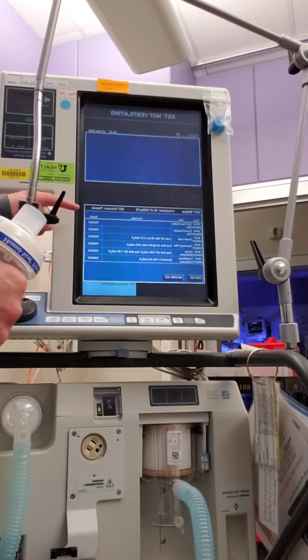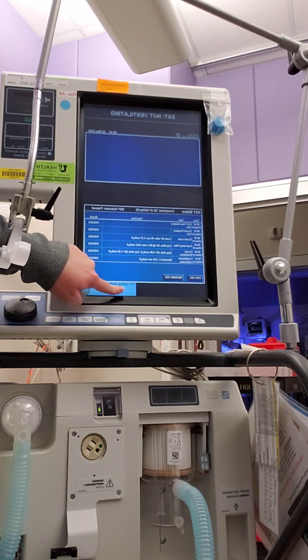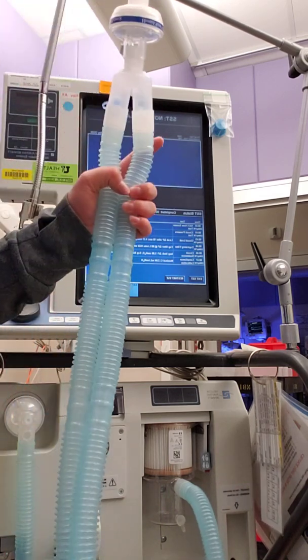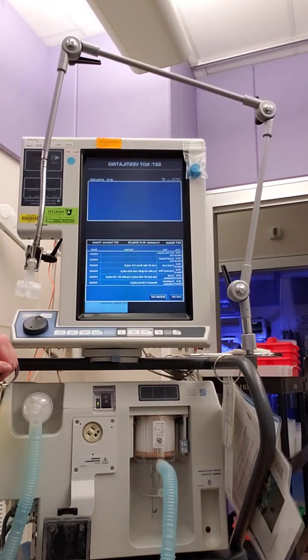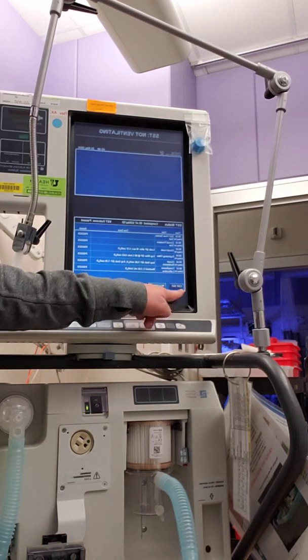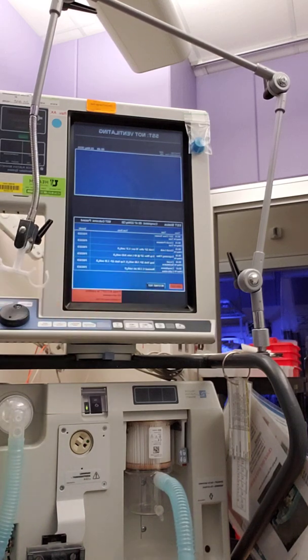Okay, perfect. So our results here, we can see that we have passed our SST. And down here it will say SST testing completed. This is the point we know that our ventilator is functioning appropriately and our circuit is appropriately set up and going to work properly for our patient. You can restart your SST here, or you can exit SST mode. Either way. We're going to exit SST. Press accept to confirm.